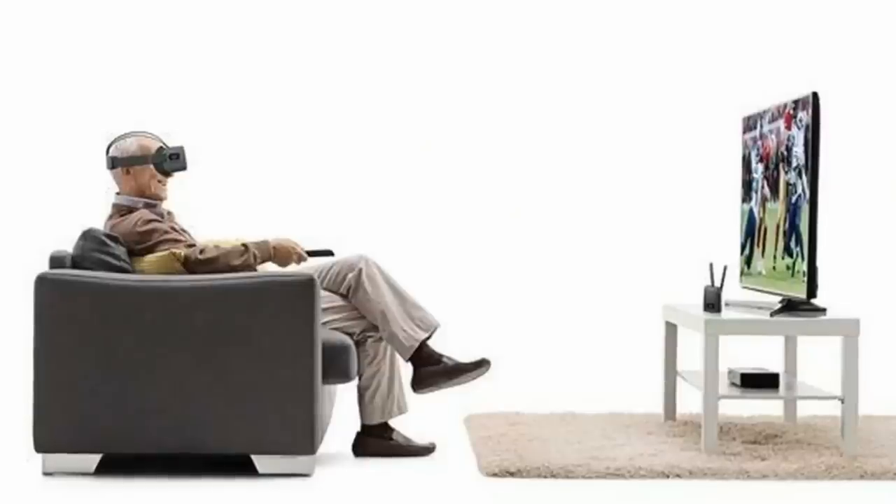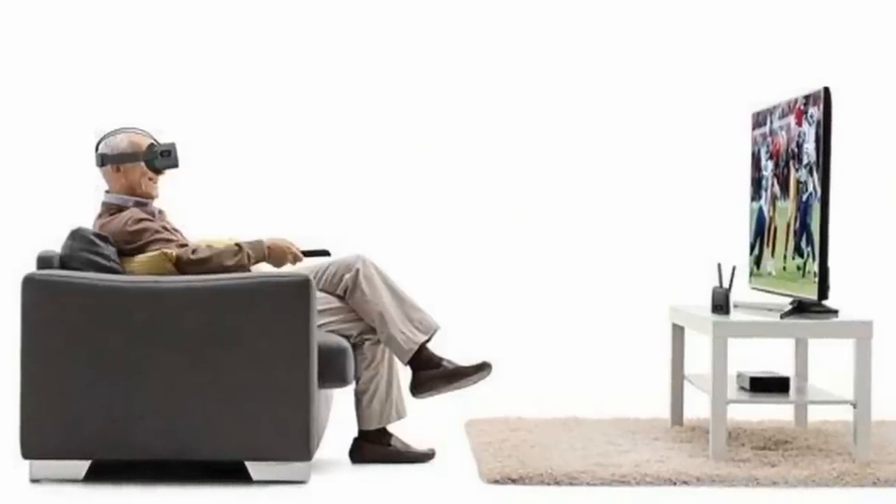With other devices, you're looking through the camera at your television, so that image is being displayed on the TV screen, then going through a camera and being displayed on the screens in the headset — losing a lot of quality through all those different lenses. The way Vision Buddy gets around that is by using a provided transmitter to send the image directly into the headset, so you're watching it on the screens within the headset without losing any quality.